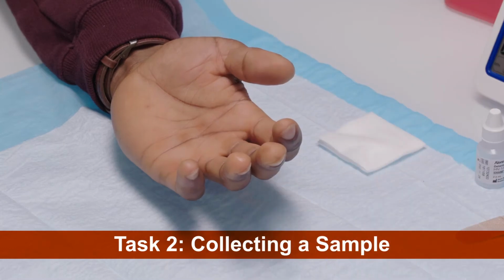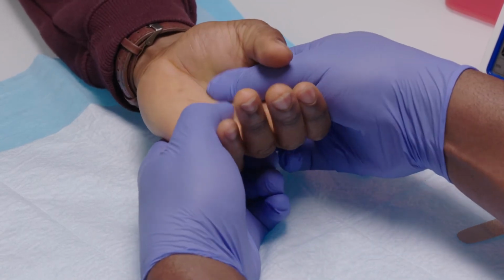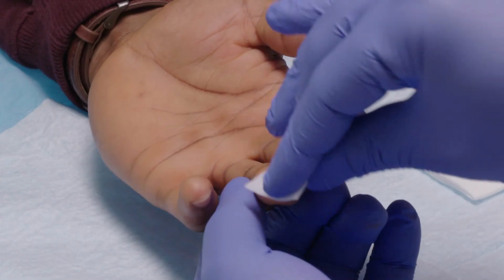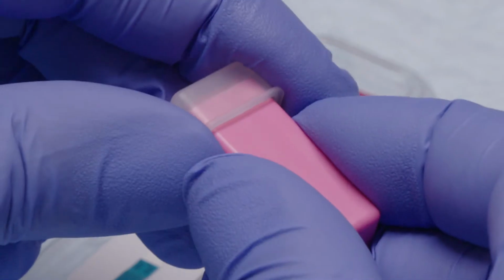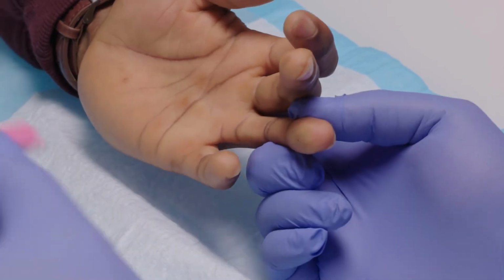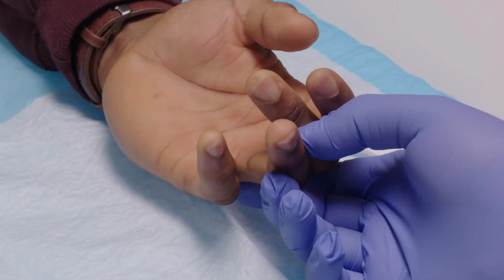To collect the sample, ask the client which hand they prefer, and then massage the client's middle or ring finger on their preferred hand in a downward motion multiple times to encourage blood flow to the area. Use an alcohol swab to clean the top of the finger and allow the finger to dry, either naturally or with sterile gauze. Uncap the lancet and rest it at the top of the client's finger slightly off from the center. Press down on the lancet to puncture the client's finger and wipe away the first drop of blood with sterile cotton gauze, disposing of it in the biohazard bag.